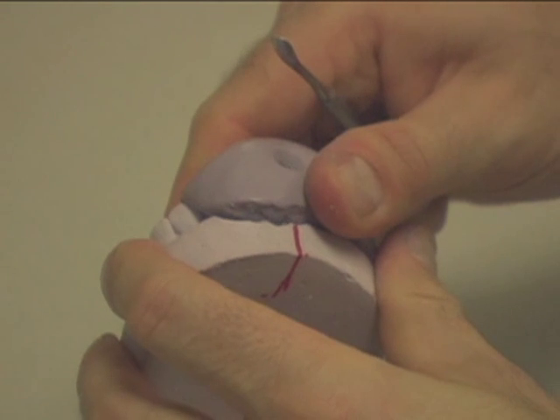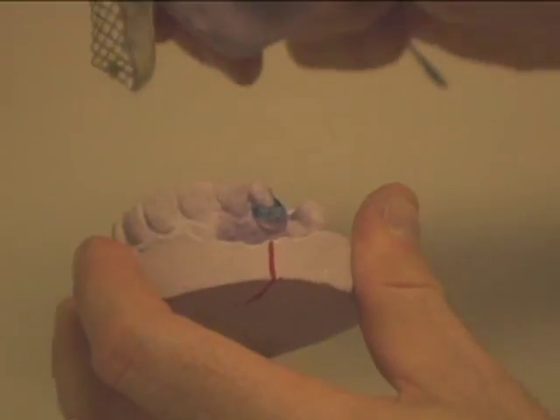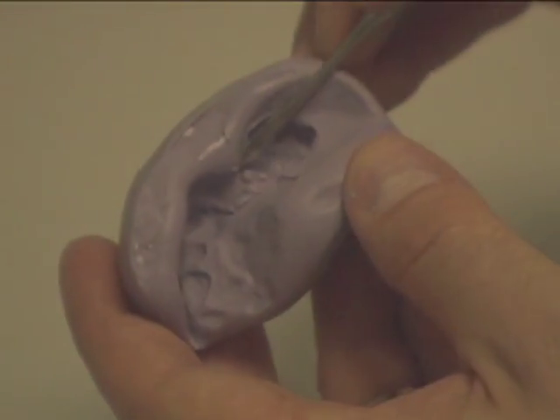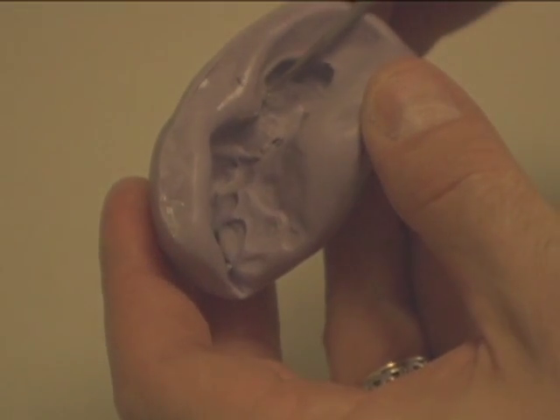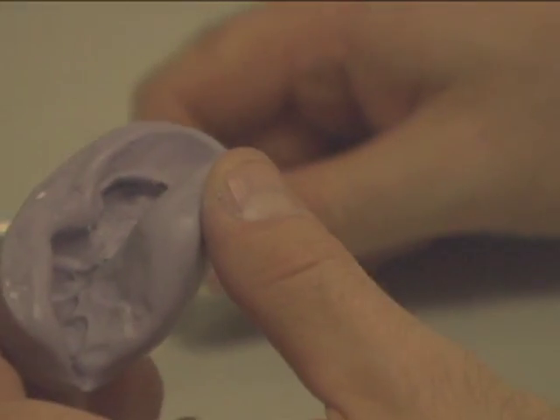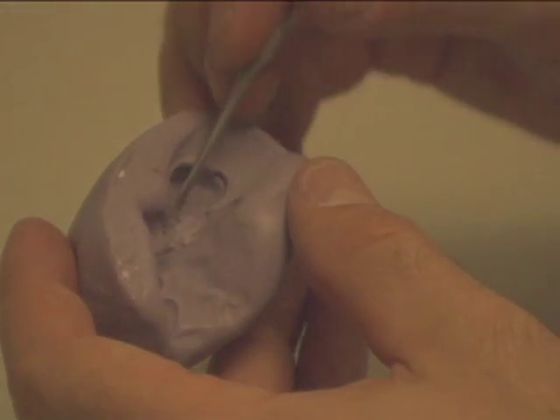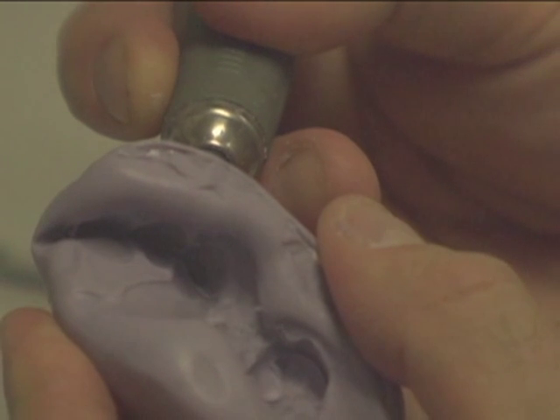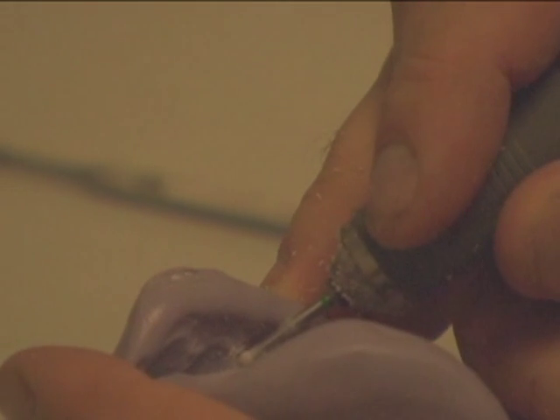Creating Sprue Hole. Remove putty and drill a sprue hole from outside to inside using the number 8, 2mm burr. Drill your sprue hole through the indentation of the putty tool and out through the other side, trying to come as close as possible to the tip of the clasp. If you come out ahead of the clasp tip when drilling, that's okay — just make a channel from the hole to the tip of the clasp. Make sure the channel is 2mm by 2mm, as that is the size of the burr, and it is important to keep everything 2mm by 2mm.